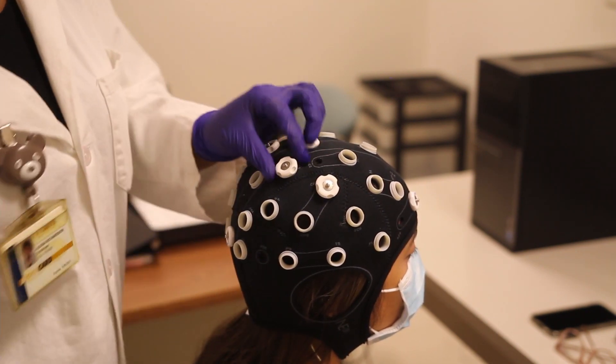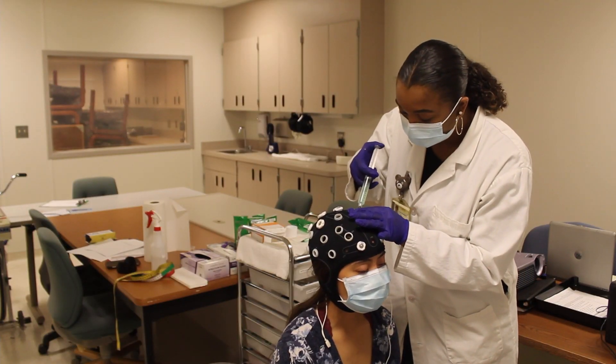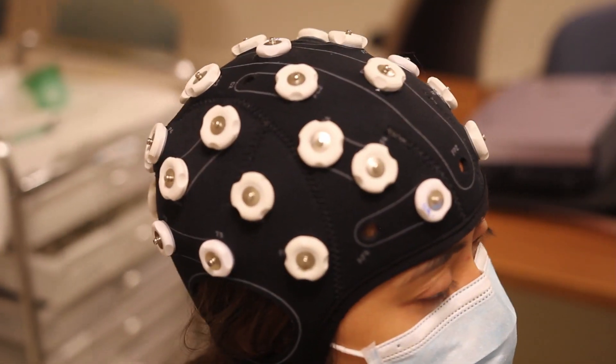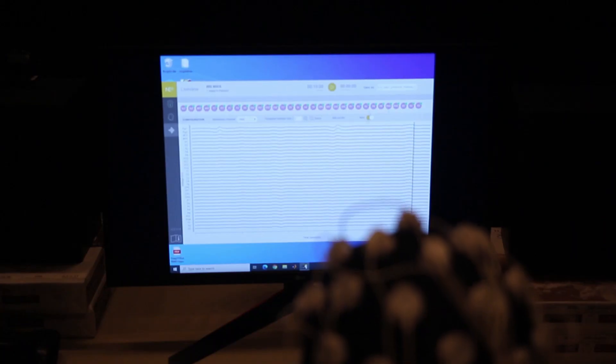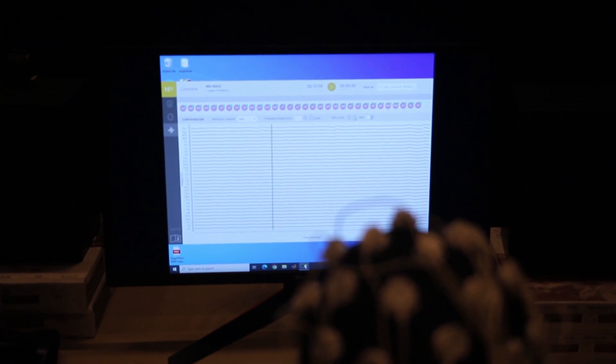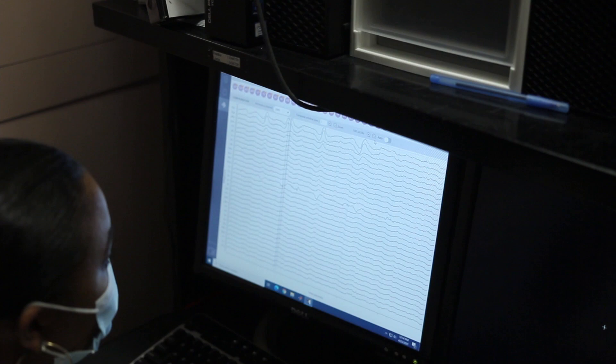We continuously check in with you during this process to make sure you are comfortable. After all the sensors have been placed on the cap, we will use cables to connect the headset to each sensor, which allows us to see the EEG signal. We will then plug in the headset so we can see the EEG signal from our computers.